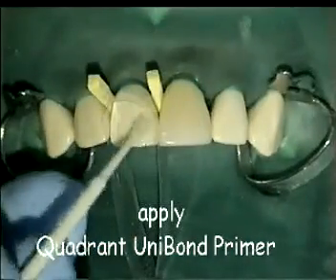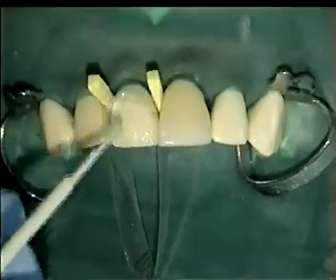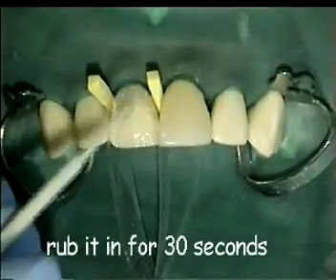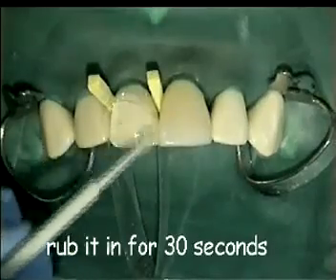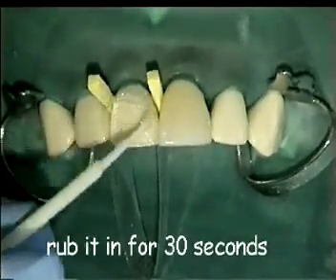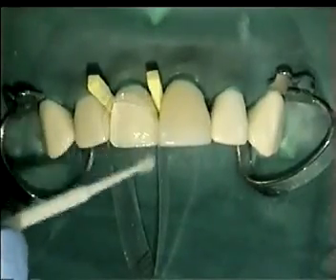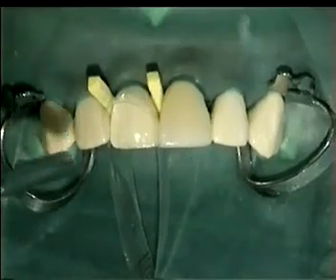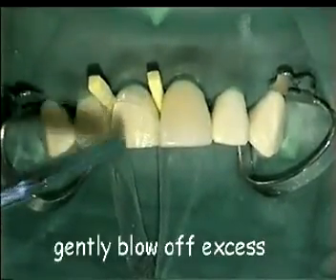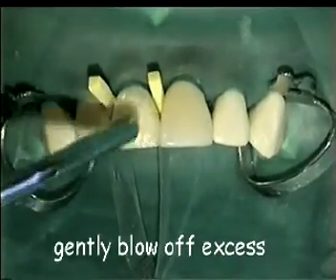Apply Quadrant Unibond primer and rub this in for 30 seconds. Gently air dry until ethanol is evaporated.